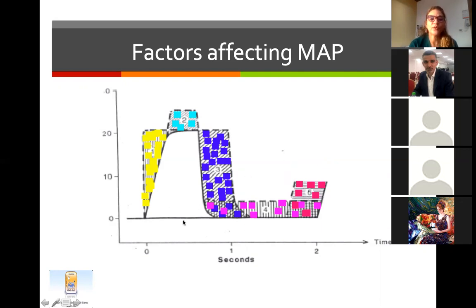So you can know where the problem is occurring, and if you have a high flow, you will have a square wave, too much square wave. If you have adequate flow, you will have a sine wave. So you want to be baby friendly and go more the physiological way of handling the ventilator. So you will always look for a sine wave and not a square wave.